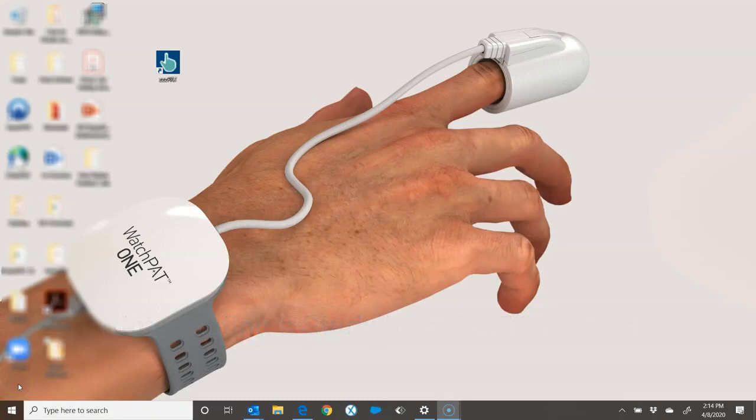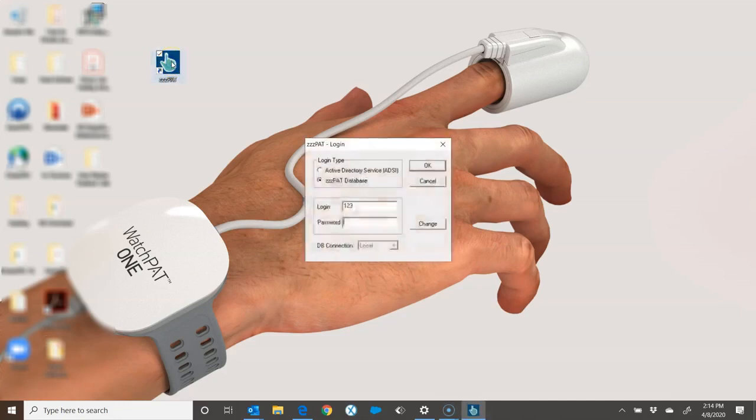Let's interpret a study using ZZPAT software. I find the icon on my desktop, ZZPAT, double click on it, and it opens.